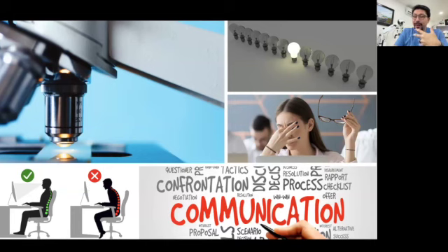You will have a better ergonomics for working more comfortably, and you will feel more relaxed in your eyes, because you are not going to force the muscles of your eyes for trying to focus in the most posterior areas, and you are not going to need to go almost above the patient, very close to the patient, trying to have a proper focusing distance. So these two reasons are related to the clinical practitioner.